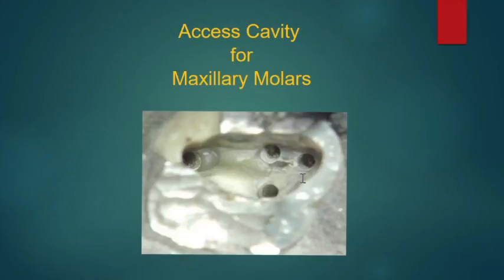while during the preparation in the distal side, we can invade the mesial portion of the oblique ridge, but we should never penetrate through the ridge.